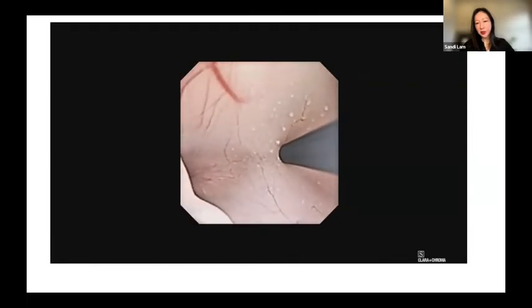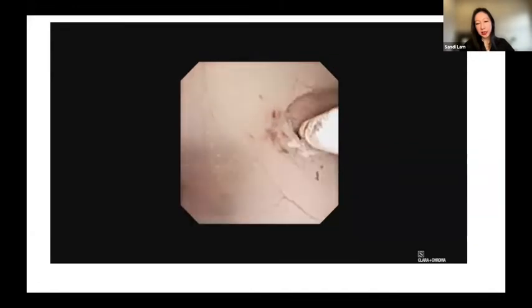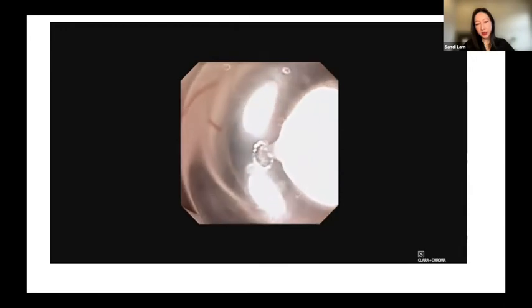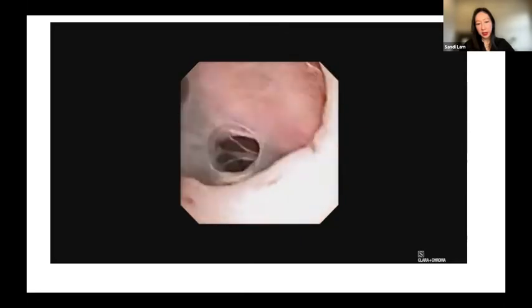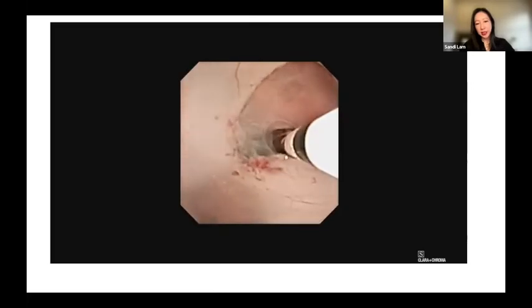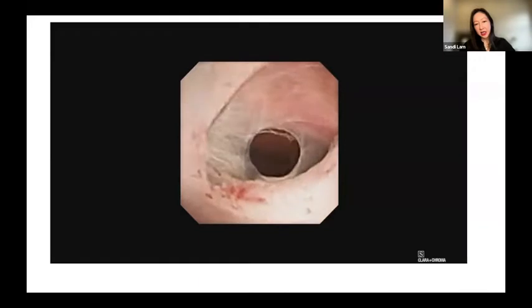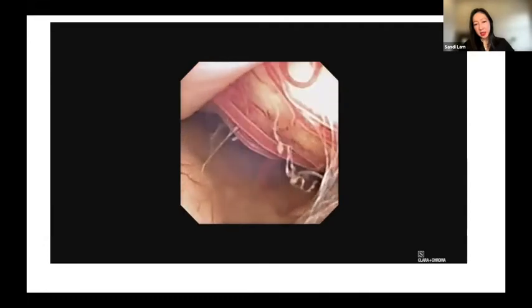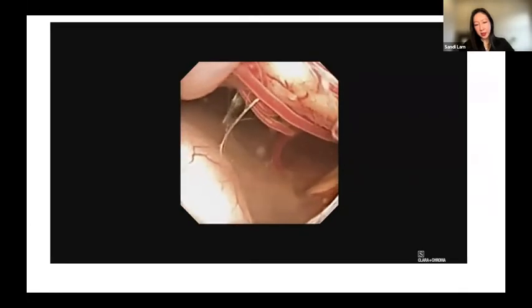I would think it's actually a more straightforward approach that we typically don't see those adhesions in the prepontine cistern like we typically do see in a post-infectious hydrocephalus or a post-hemorrhagic hydrocephalus. So here, when you blow up that Fogarty balloon and you can look in a little bit, you really don't see those adhesions in the prepontine cistern. And I would say here in a typical ETV scenario, you're done, right? So you look in, everything looks clear, and your ETV surgery appears complete. And that is a great view.